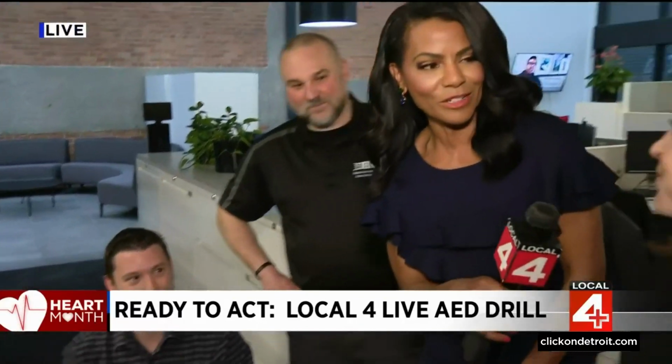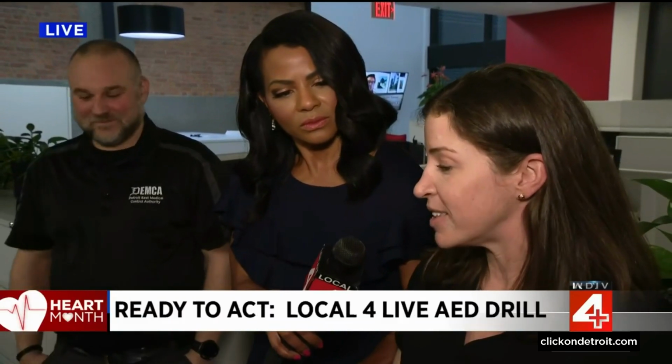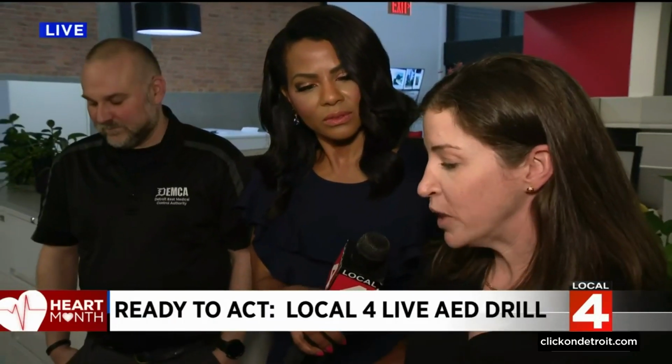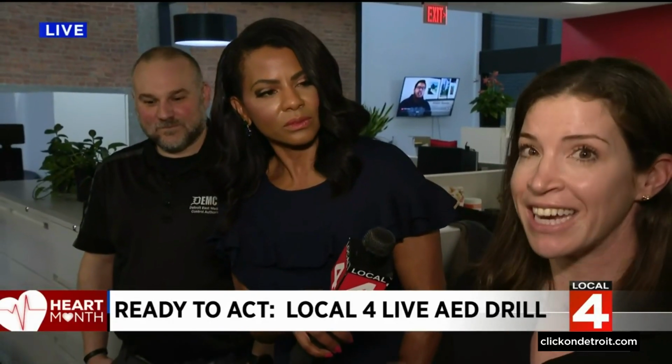All right. As a physician, Dr. Brennan, how did the guys do? They did a great job. They recognized early that somebody needed help, and they got right in there, got somebody on the chest doing CPR quickly. They got the AED out, which is what we want to see happening as quickly as possible, because we know that the things that we can do to save somebody's life are CPR and an AED as fast as possible. Okay, and the most important part is CPR is not enough. CPR buys you time until you get the AED in place. Early defibrillation will save lives. And what grade do we give our team here at Local 4? I'll give them an A. An A. Good job, guys. They've participated in our training and did a phenomenal job.